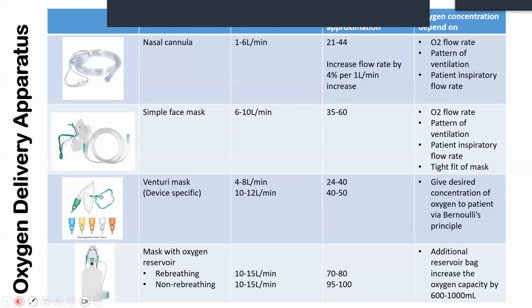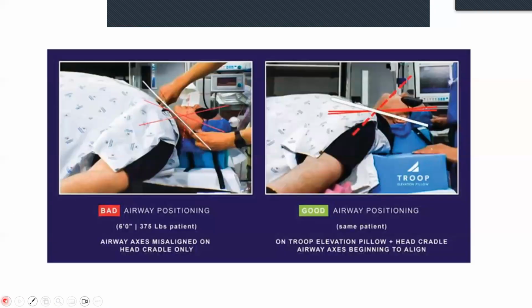And next, it can also increase the oxygenation, in which you have a longer delayed desaturation when you try to intubate the patient. Because the patient is elevated, sometimes it makes it easier in case you want to bag the patient and also attempt intubation.